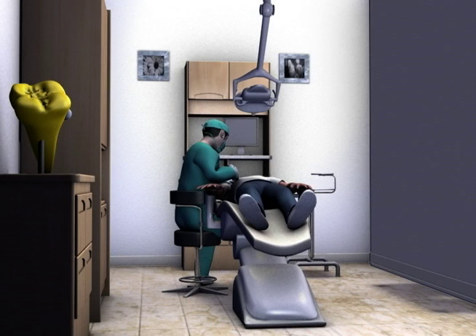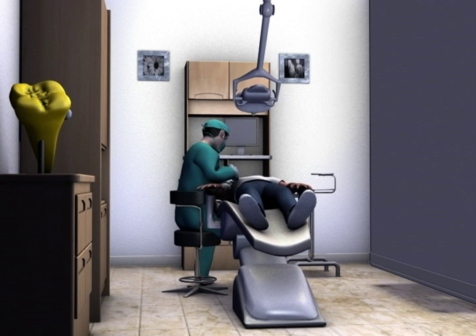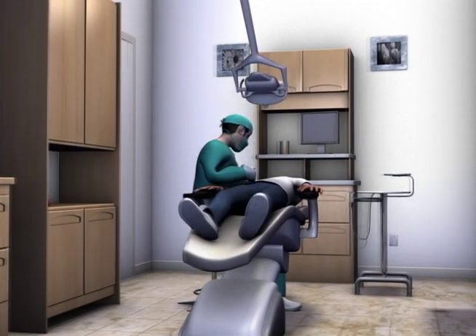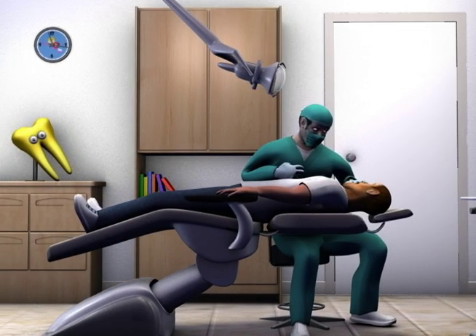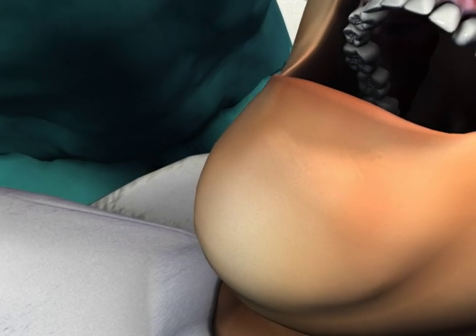A right-handed operator performing an inferior alveolar block injection on the patient's right side is seated at the 8 o'clock position, with the patient reclined in the dental chair to minimize the possibility of syncope. Our tour begins with the patient's mouth opened widely and the patient's head turned slightly toward the operator.